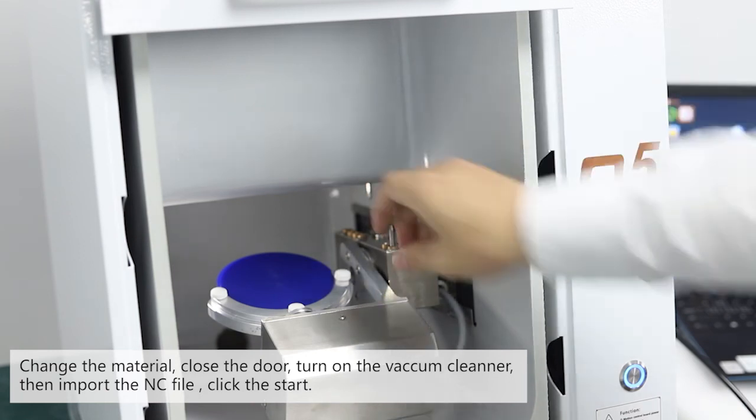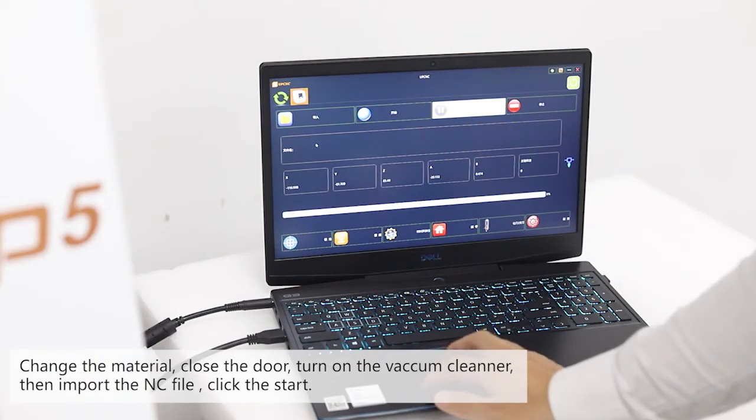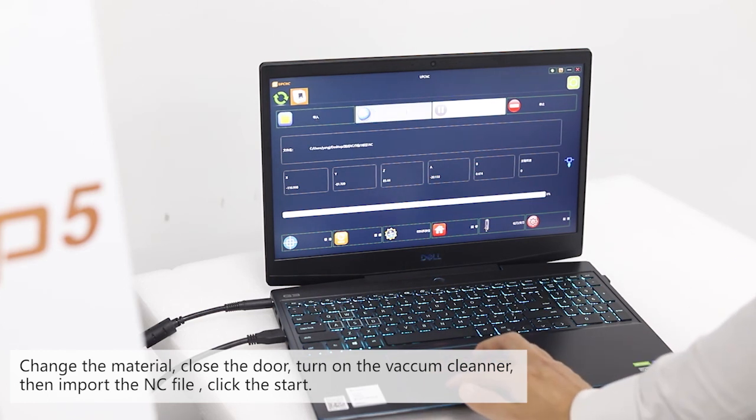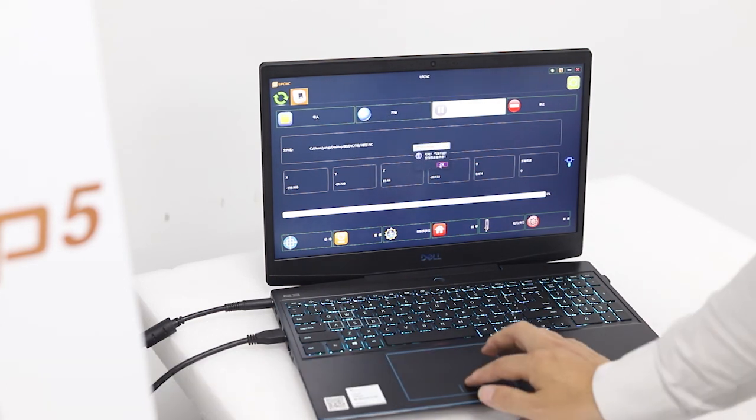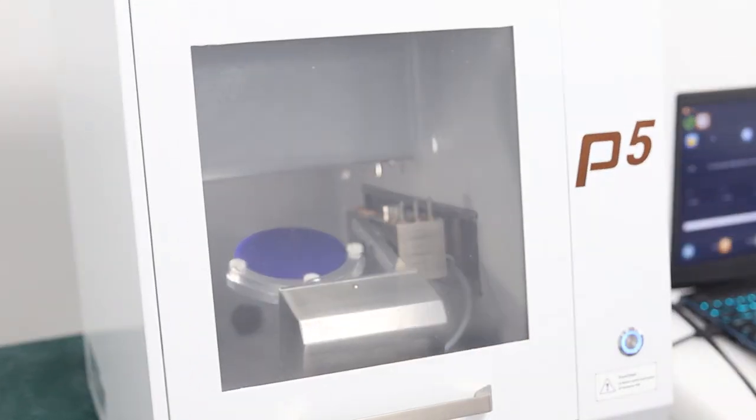Change the material, close the door, and turn on the vacuum cleaner. Then import the NC file and click start.